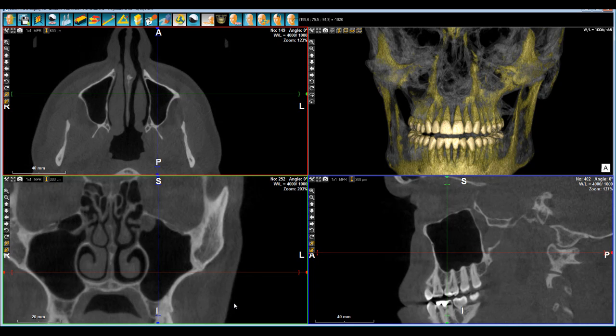The next element we are going to check is the virtual endoscope mode on WhiteFox Imaging. It's a mode that is quite easy to use because you simply need to place yourself into an area where you can virtually place the endoscope.